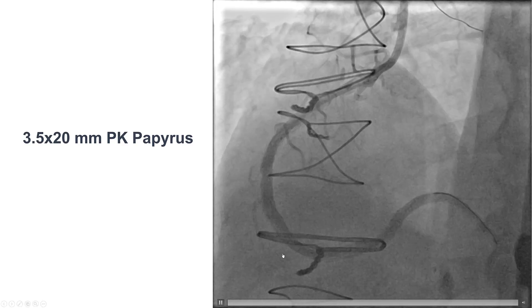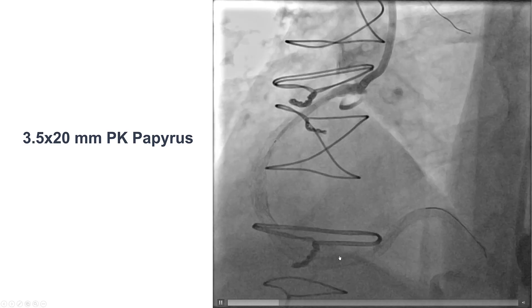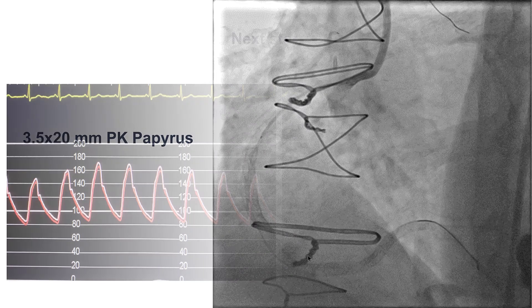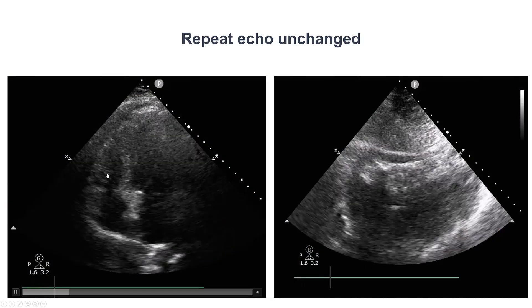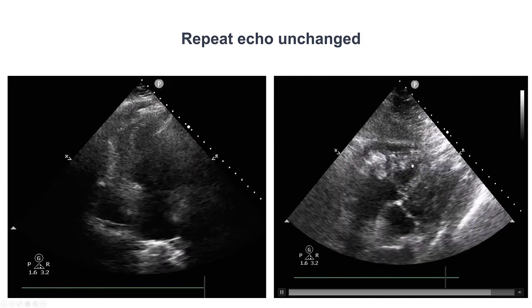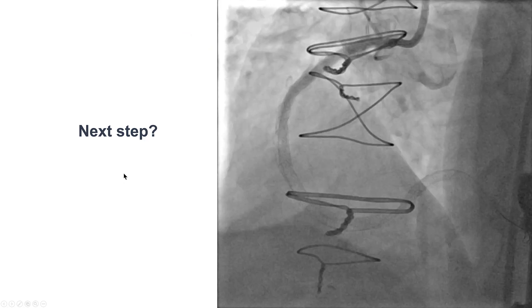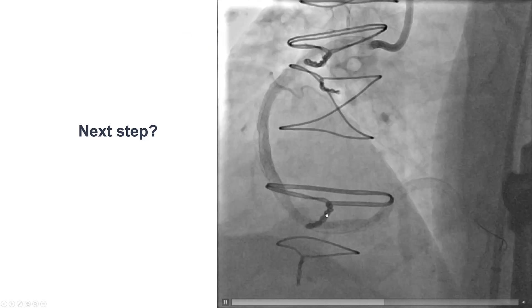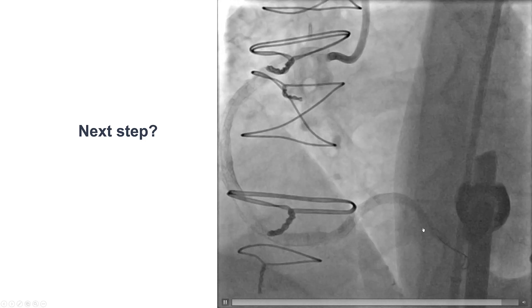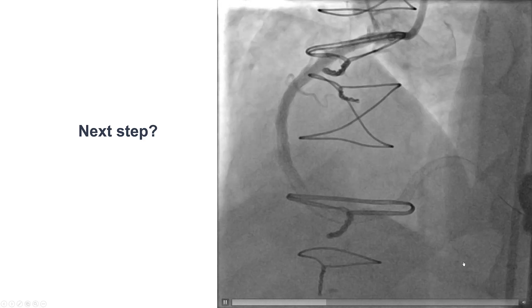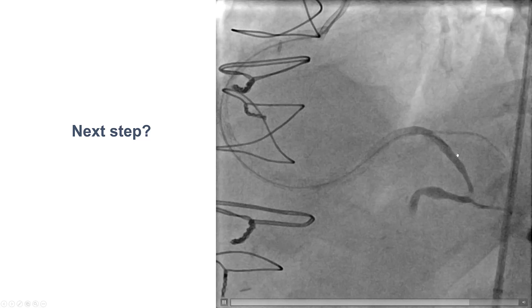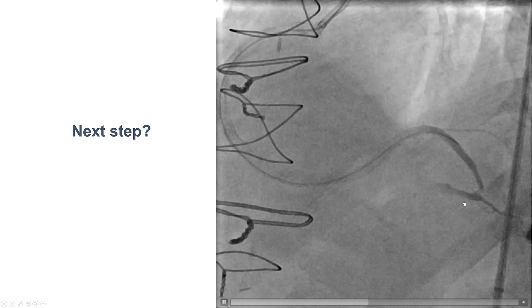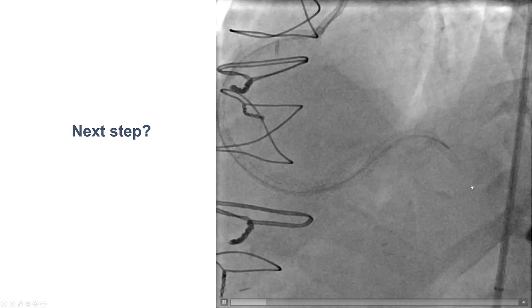We placed another PK Papyrus covered stent, 3.5 by 20, which helped achieve hemostasis, although there was still some staining around the vessel. At this point, the patient became hypotensive, dropped his blood pressure significantly, and developed ST segment depression. We were concerned for tamponade and performed an emergency echo, but the echo was reassuring — no change in the size of the pericardial effusion, which was very small. We then saw very poor flow going distally. The reason, we found out, was likely dissection or destabilization of the touchdown of the saphenous vein graft skip segment.